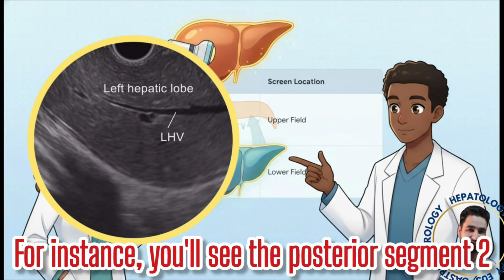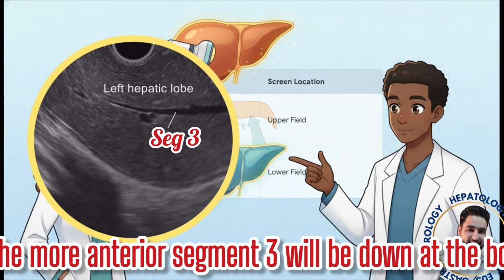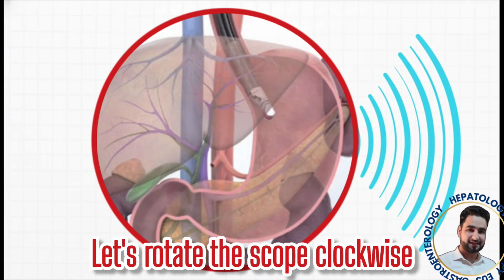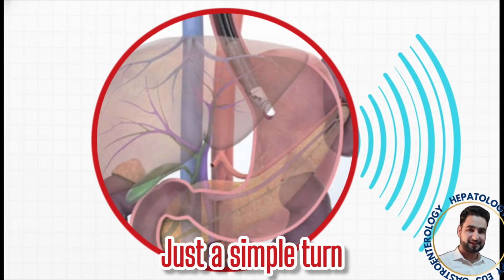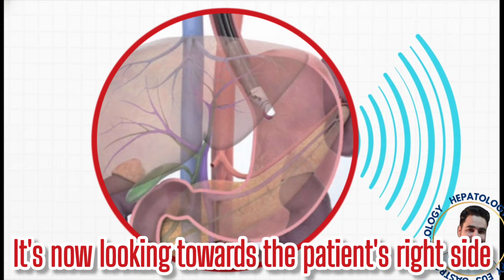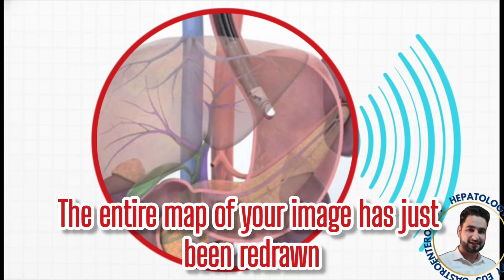For instance, you'll see the posterior segment 2 of the liver up top, and the more anterior segment 3 will be down at the bottom. But now, let's change things up. Let's rotate the scope clockwise. Just a simple turn. Suddenly, your transducer isn't facing forward anymore. It's now looking towards the patient's right side.